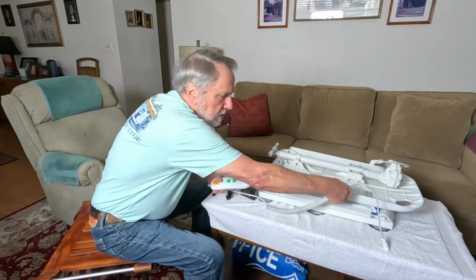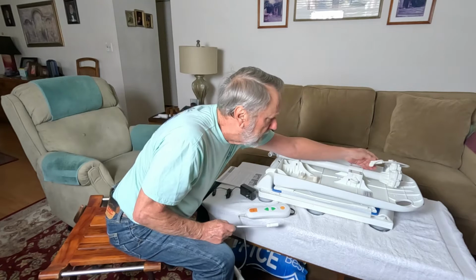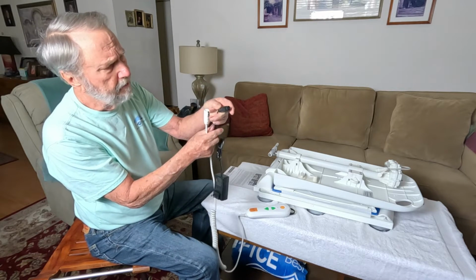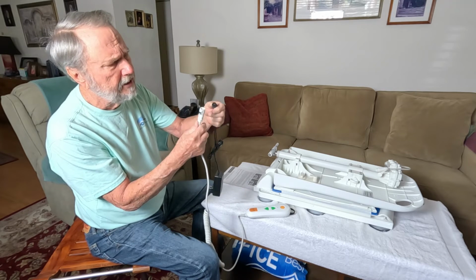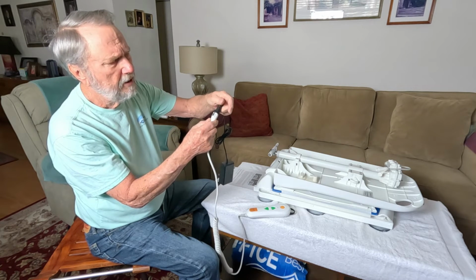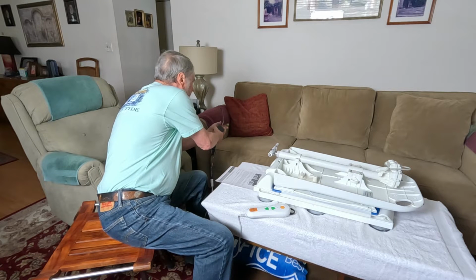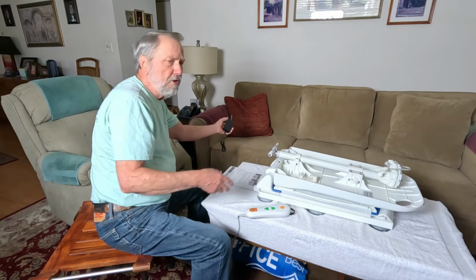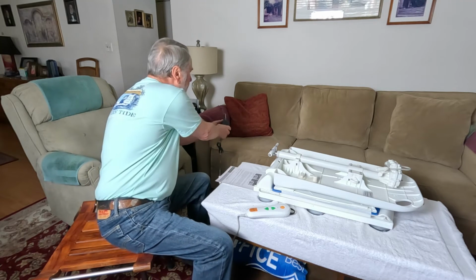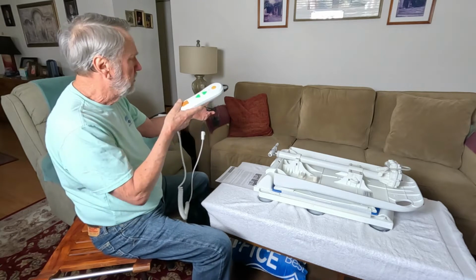Okay, so the first thing you'd want to do when you get it is charge the remote control, because it's going to provide the power, and this is where you're going to connect this. So you'll get to see how I connect the battery charger. It's got this little connector, and when you look at it, there's a flat spot on there, and this has a silver tab. The two go together, and listen, you'll hear a snap. And there, it won't pull apart. Now we can plug this in to an AC outlet, and then you'll see the red light. I've been using it to get familiar with the product, so it's not completely charged, but enough for our demonstration. We'll leave that plugged up for right now, and I'll get into the operations of it when we go to demonstrate the chair.